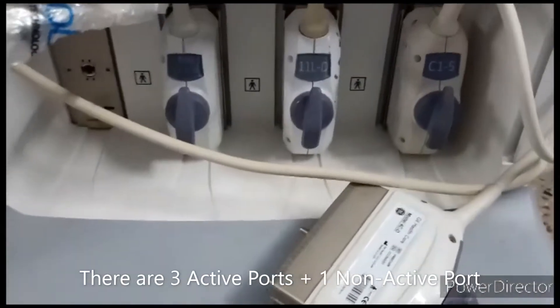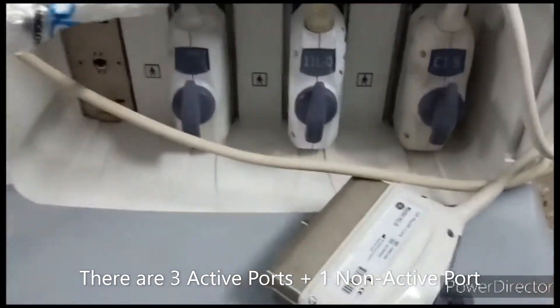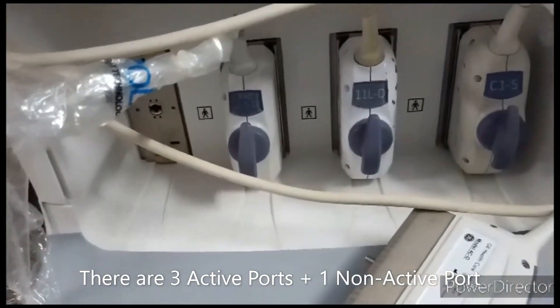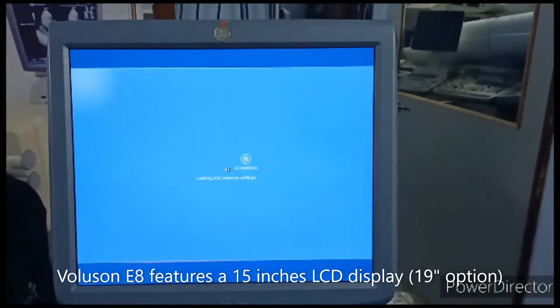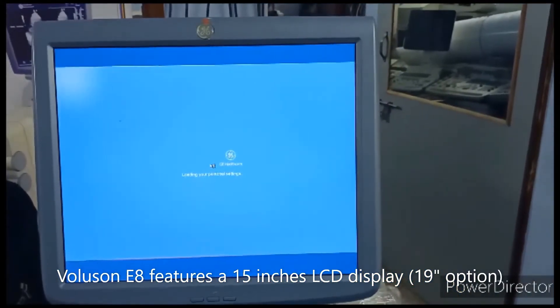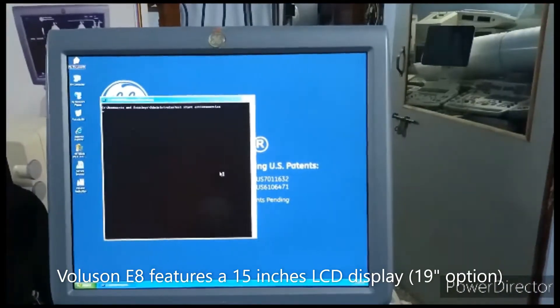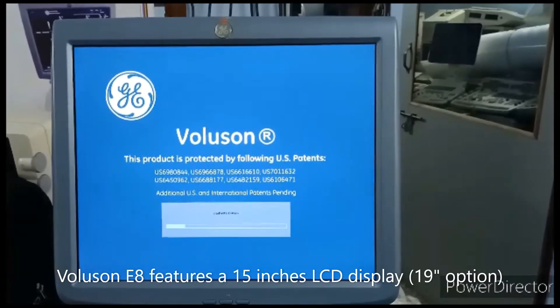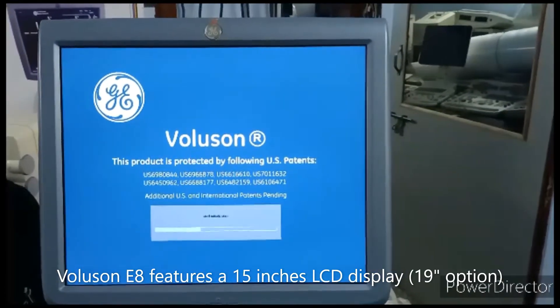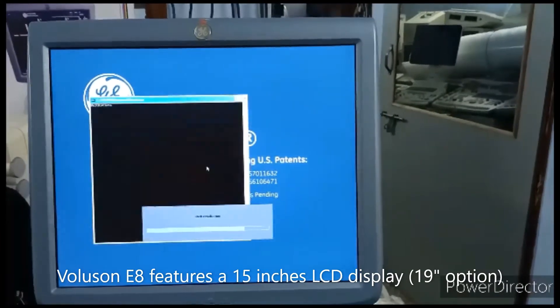This is the console, and below that you can see the active ports available — three active ports are available and one is a parking port. You can see the display: this is a 15-inch LCD display. The machine is still booting up; once boot is completed you can see the scan area.